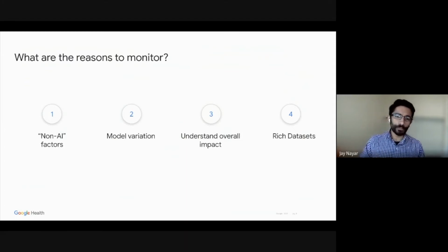We have learned through our deployments in different geographies that although the product is designed in a certain way, there are just a myriad of factors when it comes to user implementation that can impact the product's performance. For instance, even factors such as the size of a clinical room for the patient, where an image was taken, can impact the AI device that just evaluates these images.